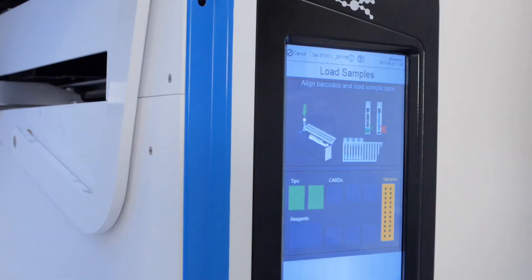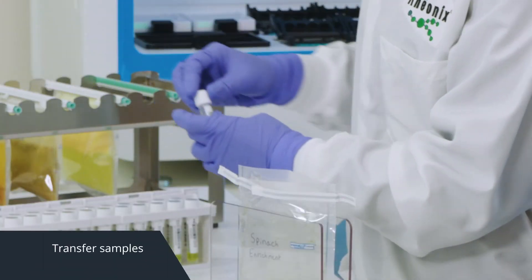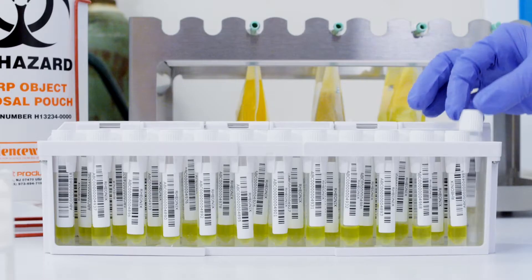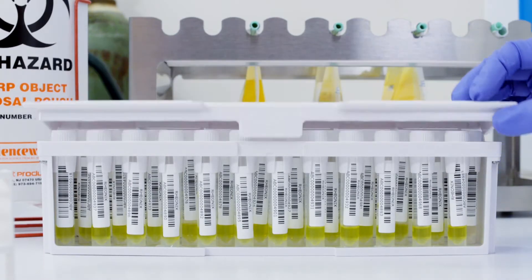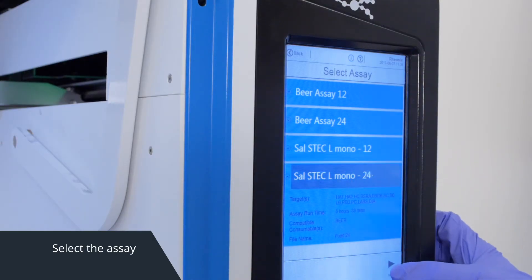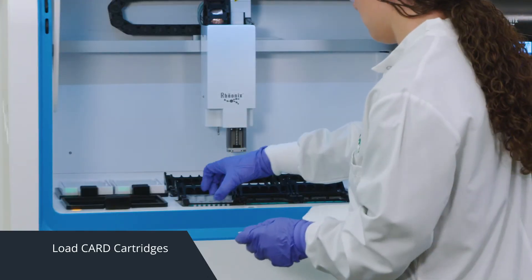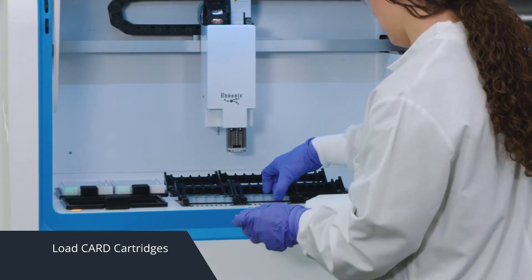No technical training is required to run the Encompass Optimum. The workstation will guide you through each step. Simply transfer your samples and load them into the Rheonix sample rack. The sample tubes are barcoded and scanned internally for increased traceability. Select the assay you wish to run, then load the sample rack onto the workstation.